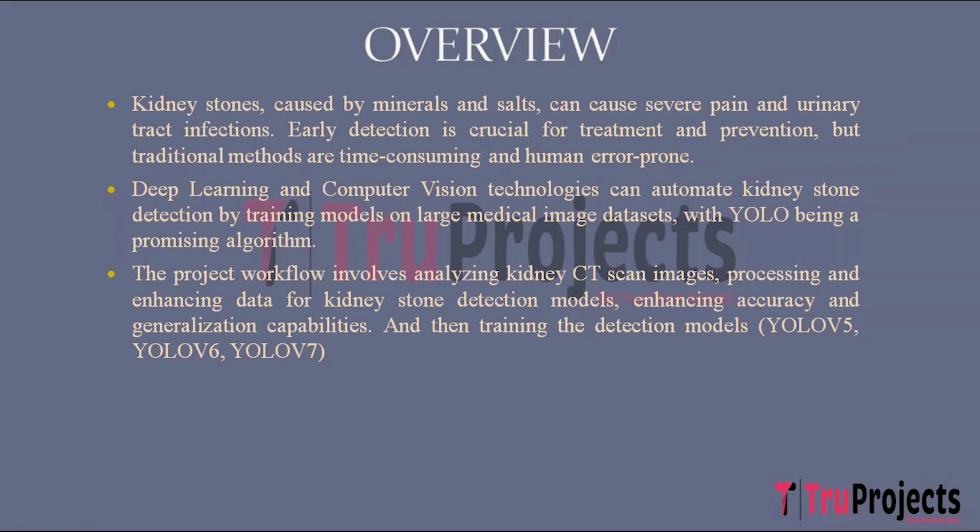So this is what happens in image processing, and data augmentation involves techniques like randomizing, rotating images, translation, scaling, and shearing to enhance the dataset's diversity and enable the model to handle imaging conditions effectively.